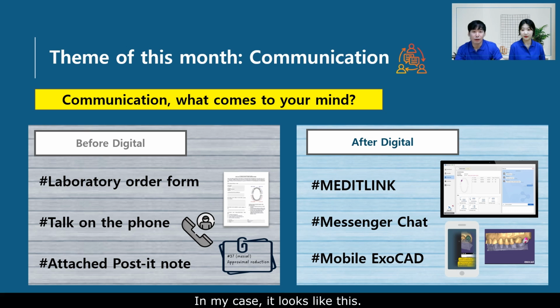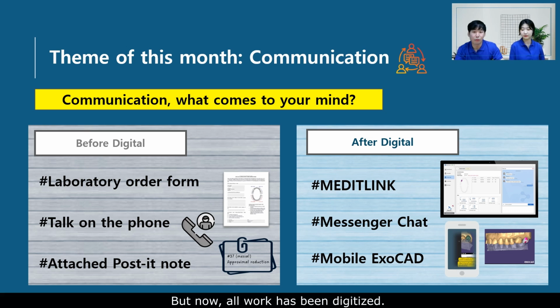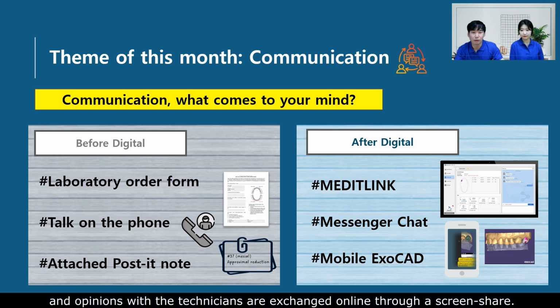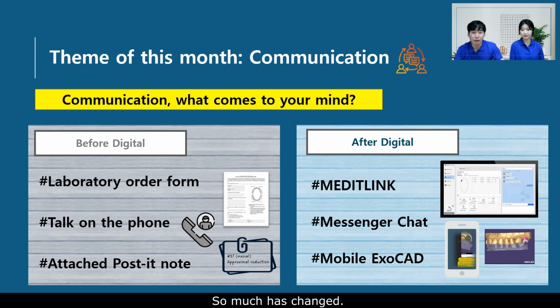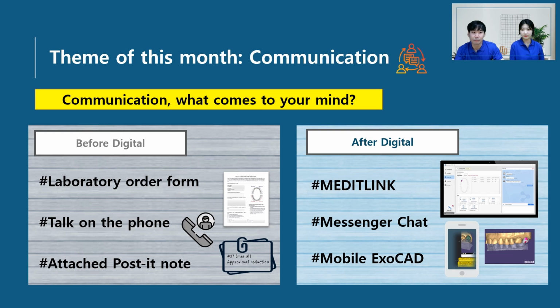In my case, it looks like this. When I think back to the days before digital, there were laboratory order sheets, phone calls to check progress, and post-it notes attached to stone models. But now, all work has been digitized. Orders are made online through Medit Link, and opinions with the technician are exchanged online through a screen share. So much has changed, but I'm not sure if this digital change in communication is more effective.